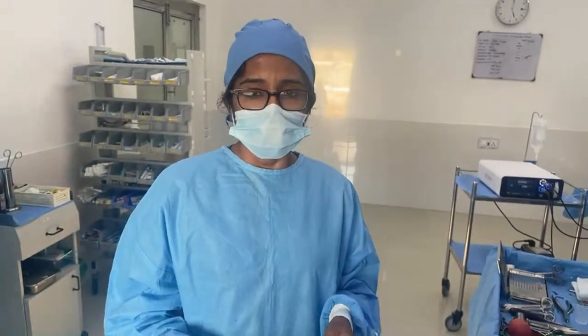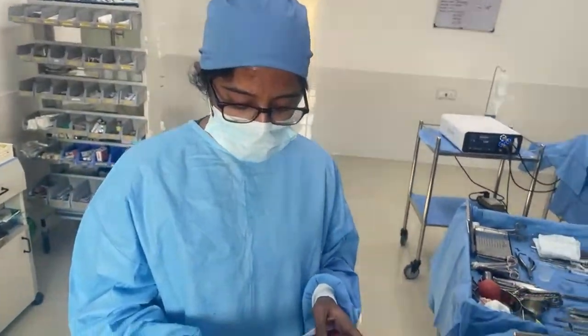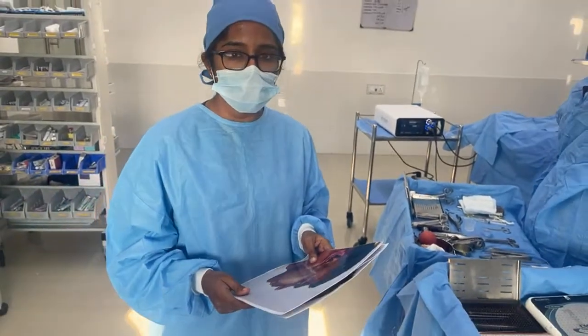We can even do an osseous genioplasty or reduce it in some cases, but that's very rare. There's extended genioplasty, sliding, different forms. But for this patient, it's going to be a straightforward horizontal as well as vertical augmentation, more in the horizontal dimension.